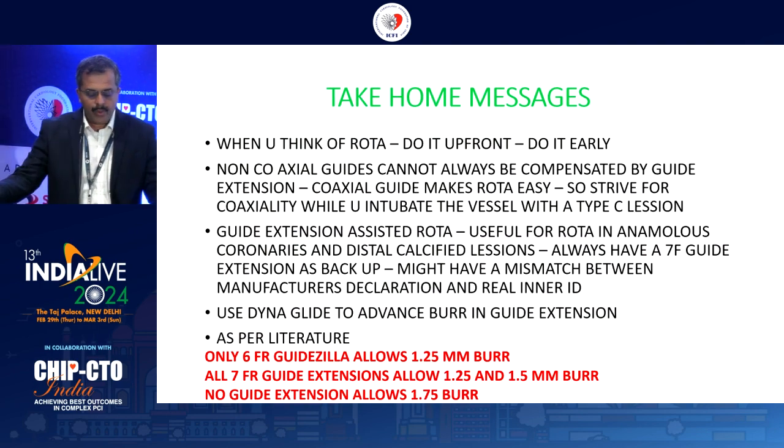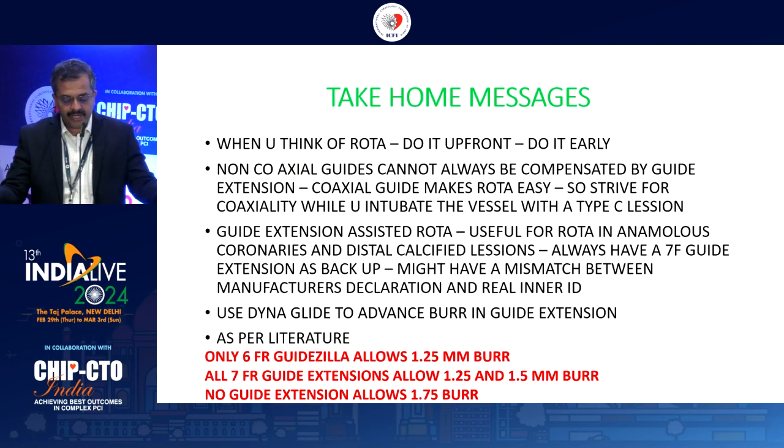So to conclude, when you think of Rota, it's always better to do it upfront, do it early. Non-coaxial guides cannot always be compensated with a guide extension. Coaxiality of the guide would obviously make Rota easy, so always try for coaxiality while you intubate the vessel, whenever you're dealing with a type C lesion. We tried different angles with the balloon, but we just couldn't make it coaxial.